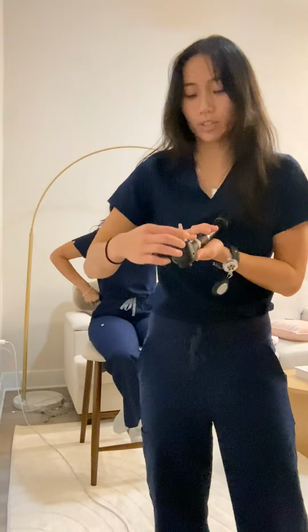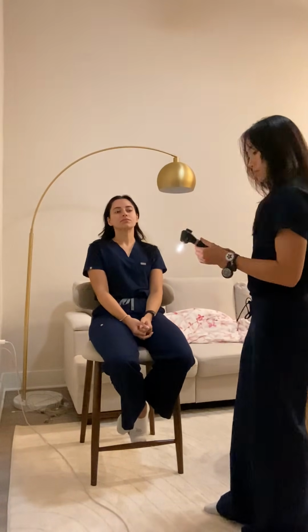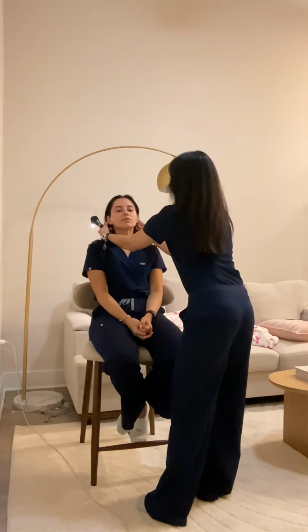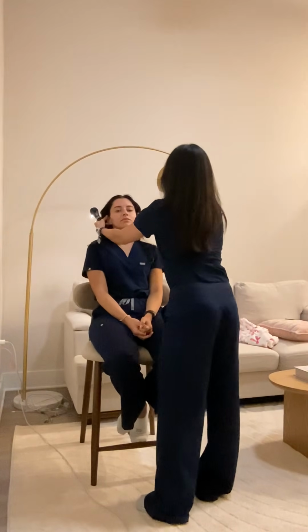Alright, I'm ensuring proper size of the speculum, turning on the light. Perfect. I'm going to use my pinky as a fulcrum for stability as I look into the external ear. First, I'm going to palpate the auricles bilaterally before I begin. Perfect. And I'm assessing for any discharge, any lesions, and any deformities.